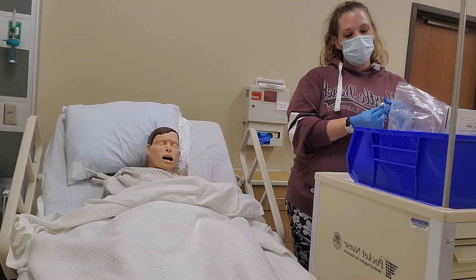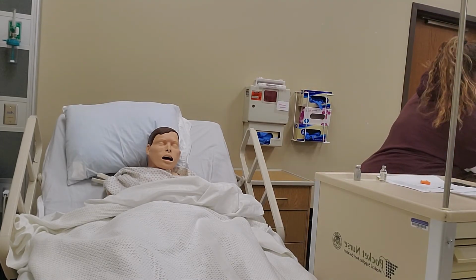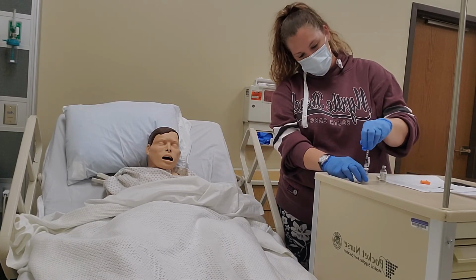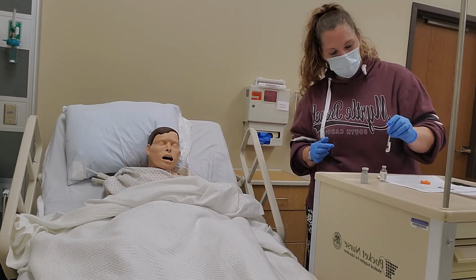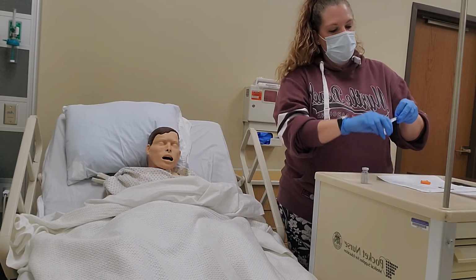So I'm gonna inject 5 units of air into the NPH. Okay, and then I'm going to inject the air into the regular and draw up 5.